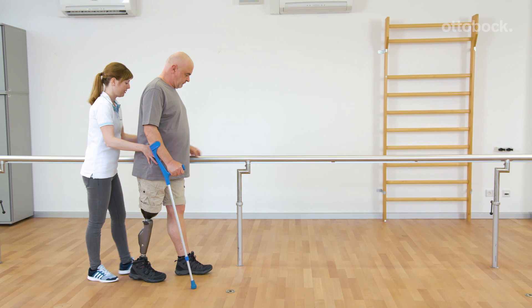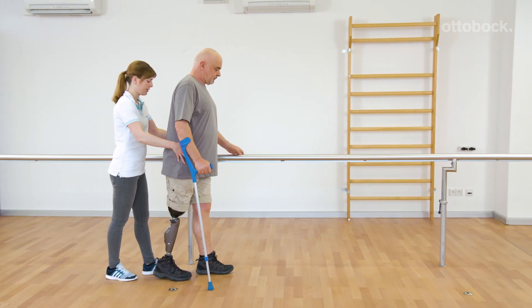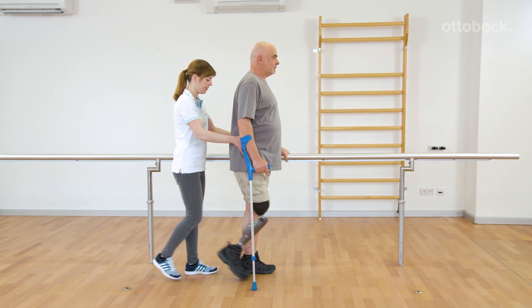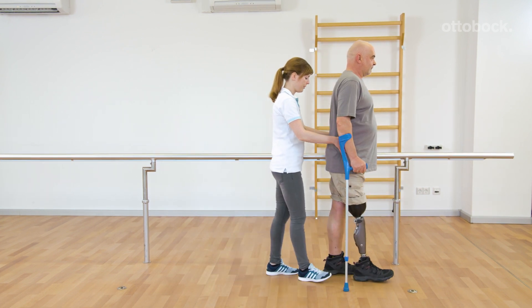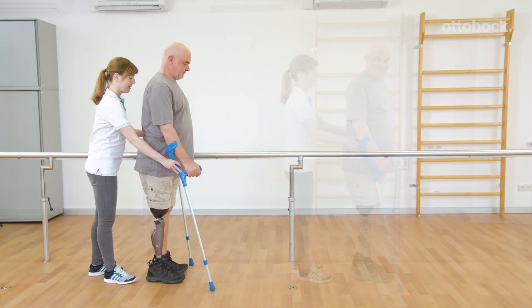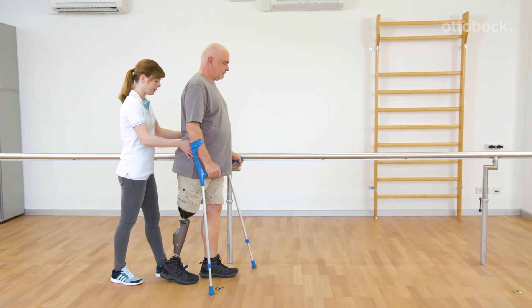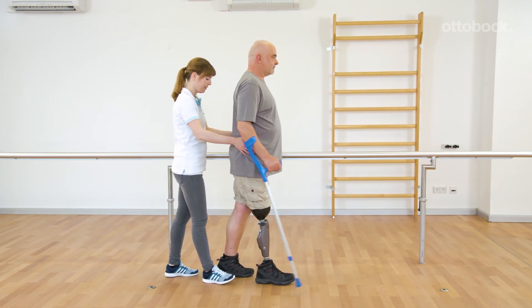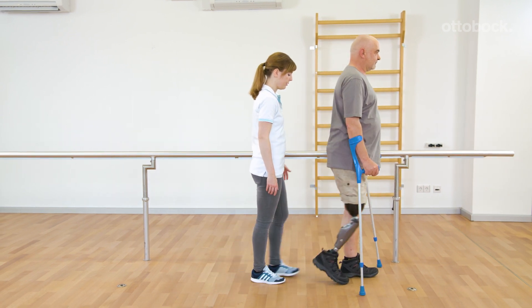Due to the increased focus on correct hand and foot placement, a discontinuous movement pattern may occur and stance release may not be triggered. A fluid motion sequence triggers stance release, and this includes shifting the center of mass over the prosthetic leg and knee extension during terminal stance. Counting out loud supports Gerhard's coordination of a fluid walking rhythm.